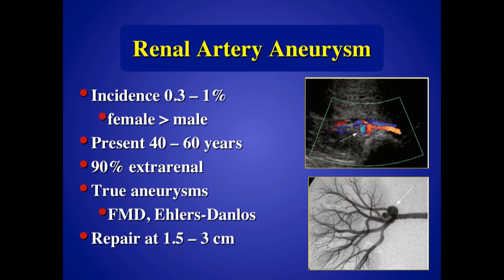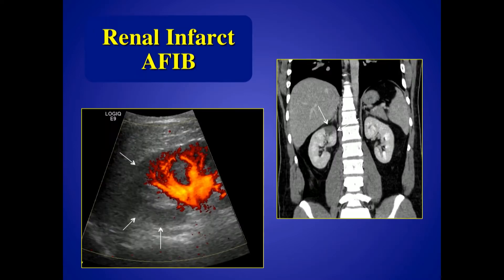True aneurysms are related to connective tissue disease like Ehlers-Danlos, and you typically wait for two to three centimeters before considering intervention. We also pick up infarcts — patients presenting with back pain or hematuria, as in a patient with a history of atrial fibrillation who developed hematuria and pain. You can see very nicely the wedge-shaped defect in the upper pole on the Power Doppler study. The patient went on to have a CT scan just to confirm the wedge-shaped abnormality.